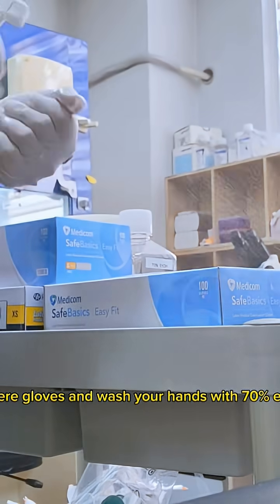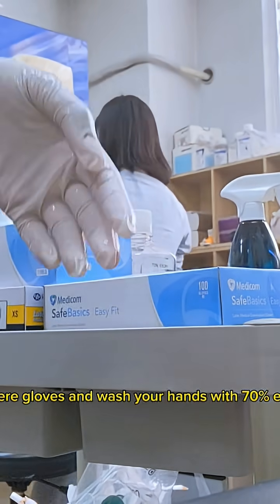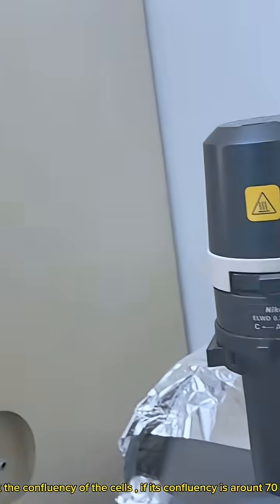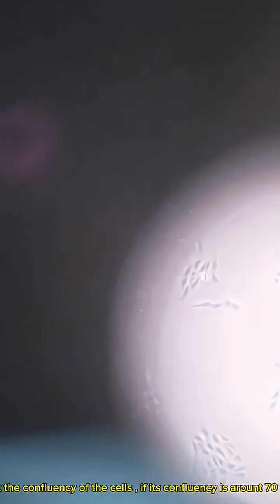First, wear gloves and wash your hands with 70% ethanol. Take out your cells from the CO2 incubator and check the confluency. If the confluency is around 70-80%, you can store them in cryo vials for future use.